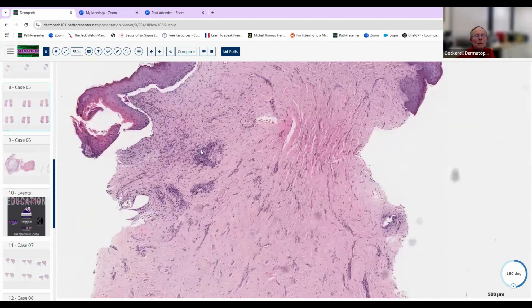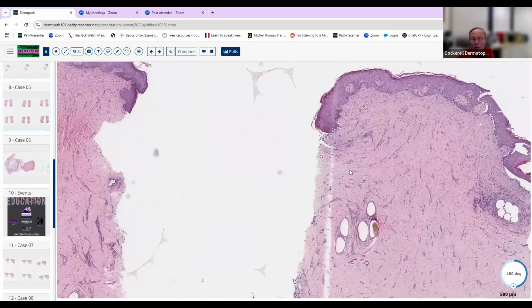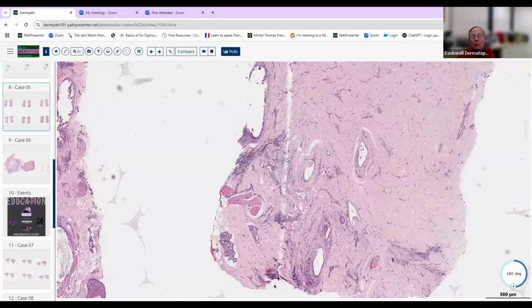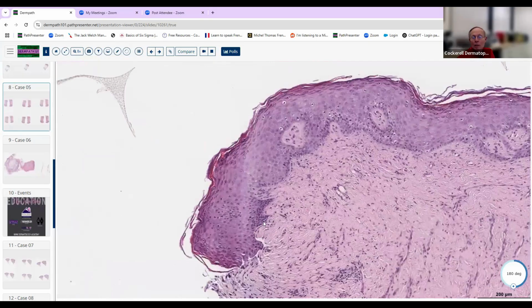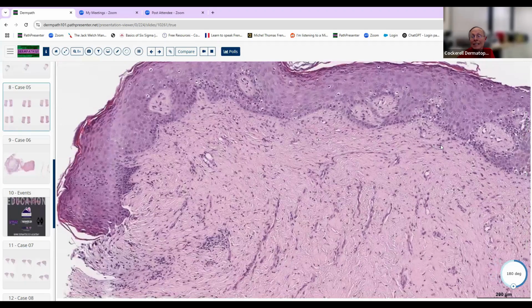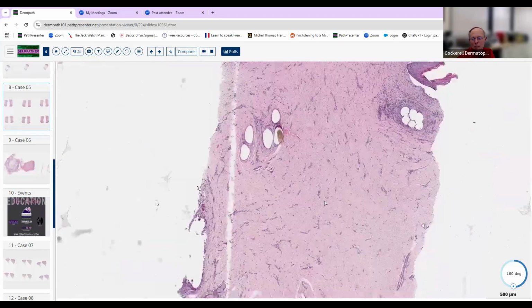We just see this scar with a few little lymphocytic infiltrate. So we're not sure what this is, but based on these clues here, it's probably either CCCA or lichen planopilaris, and I would almost kind of favor CCCA when it's this extensive and this diffuse scarring that you see over a broad front. Another clue is if you look at the epidermis and you see some epidermal hyperpigmentation, because that often occurs in individuals that are of African-American descent. We don't really see any of that here. So again, that doesn't prove that it's not CCCA, but I would probably tend to favor that.